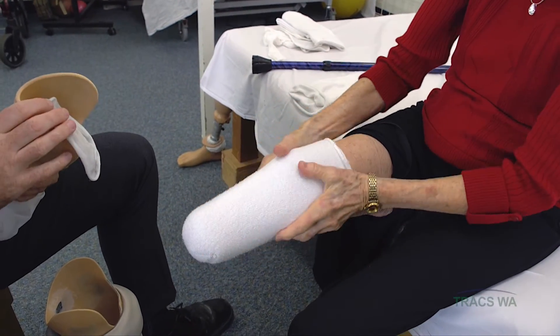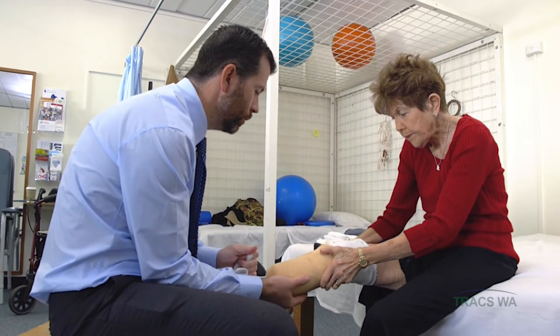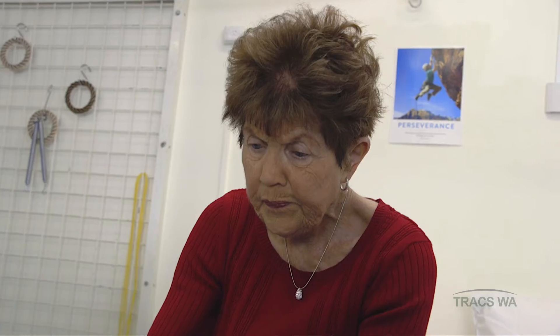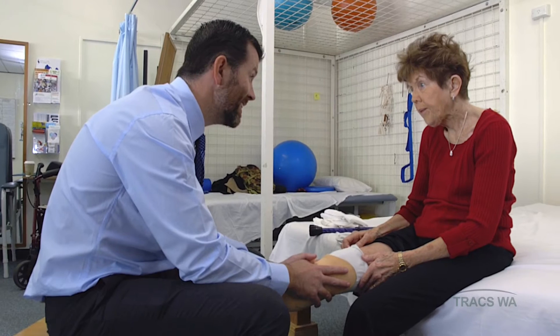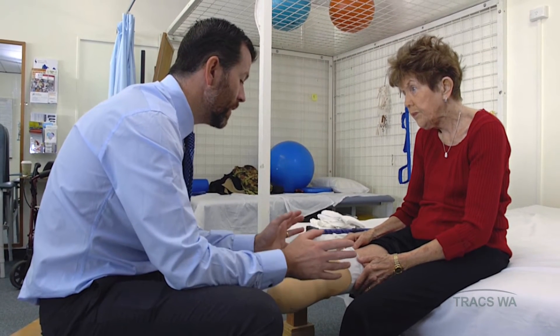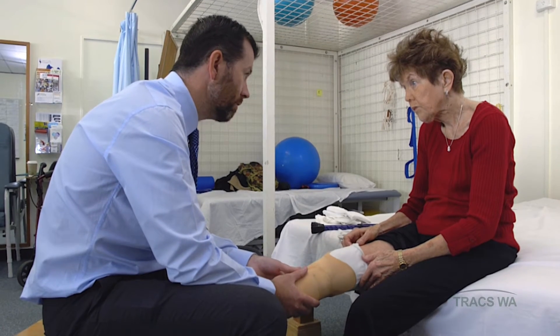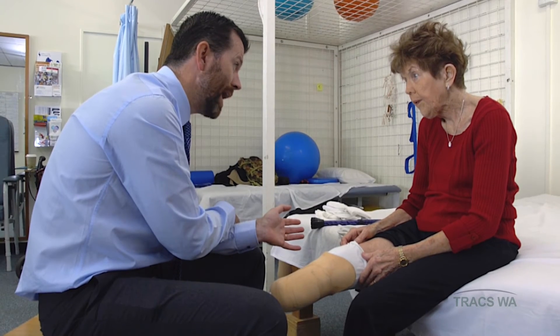Let's try two thick socks to see how that looks today. You can feel that's quite a bit thicker. Using the nylon pull-through sock — you can see straight away that it's really not going in happily. If you were to try and wear the prosthesis like this, it will get uncomfortable and not be as safe — not a good outcome. So like that, too many socks, we need to reduce back.